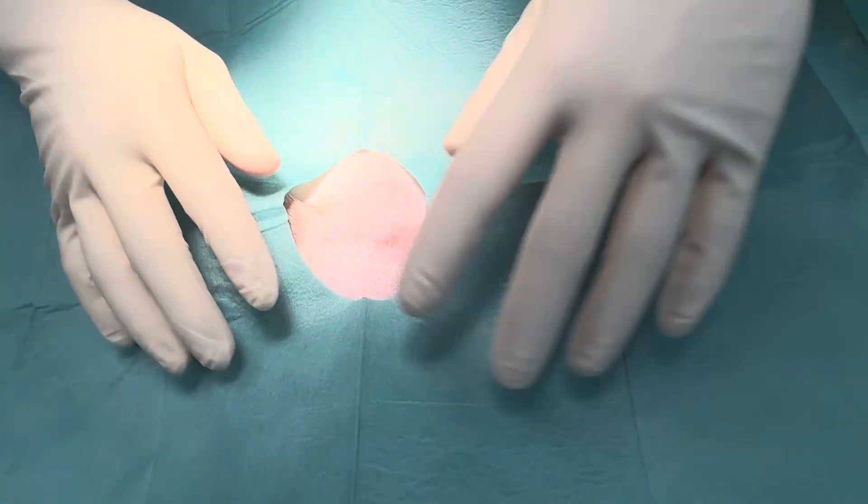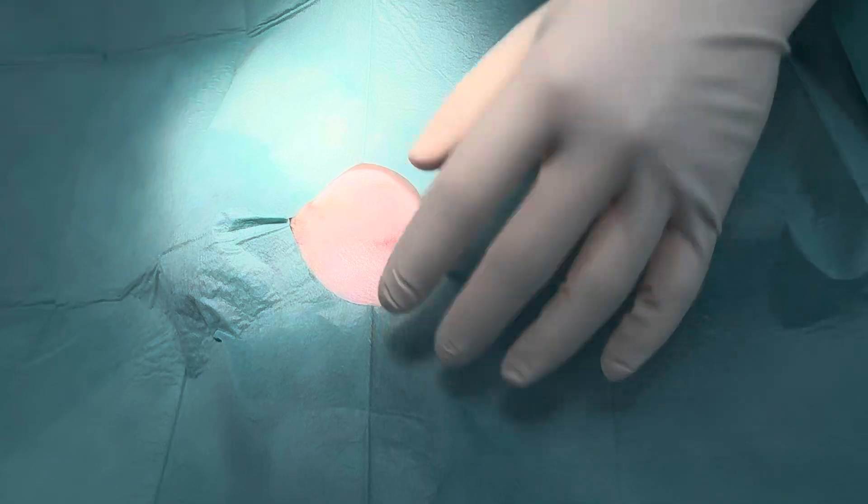Hi guys, Daniel again. Today we're doing a routine castrate in a large dog. I'm going to show you how I do a closed castration — very straightforward. I'm going to use Vicryl 3-0 to close up, and for my ligatures I'm going to use some catgut.